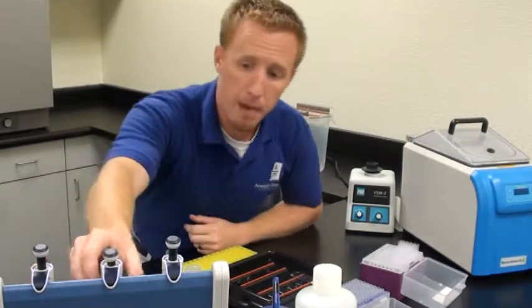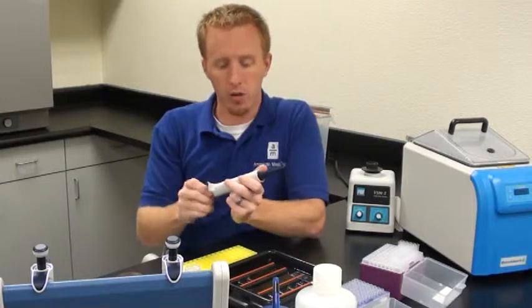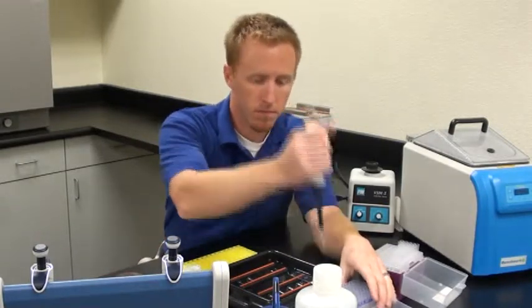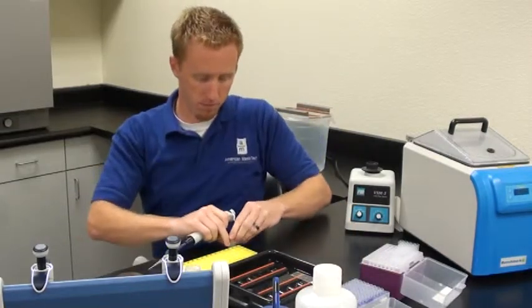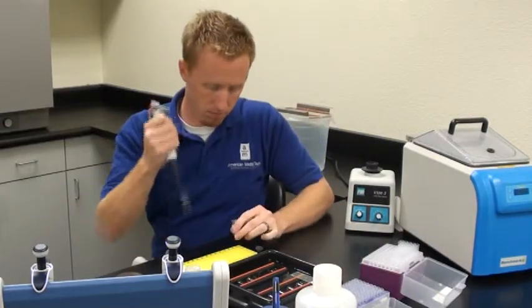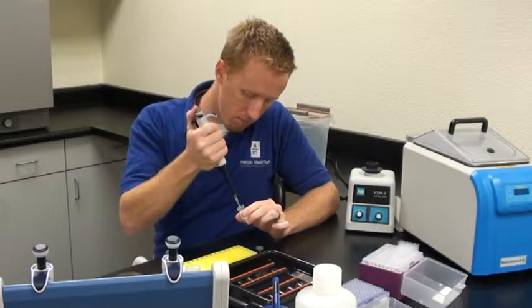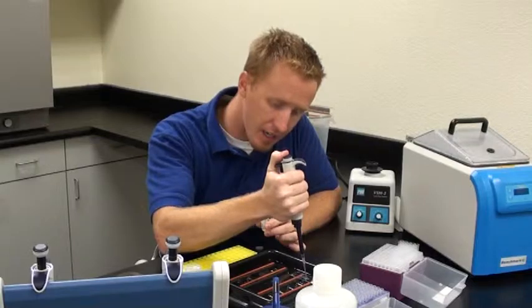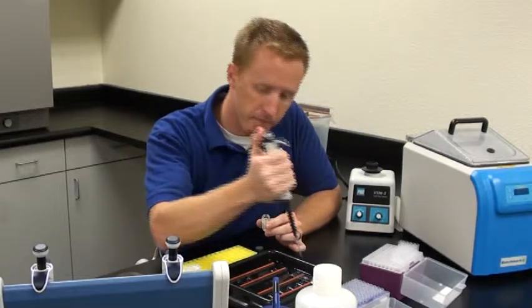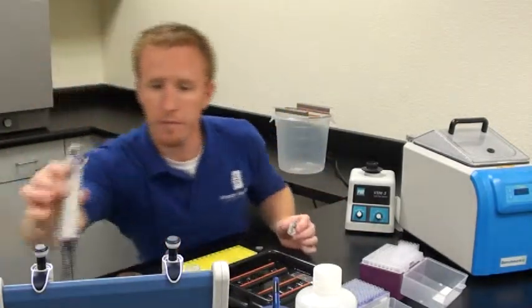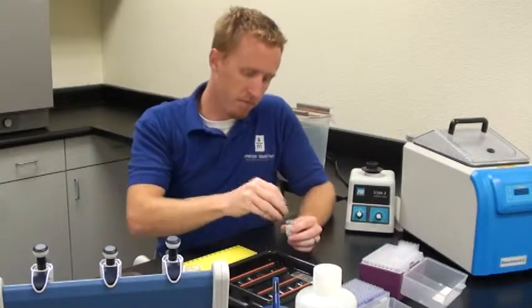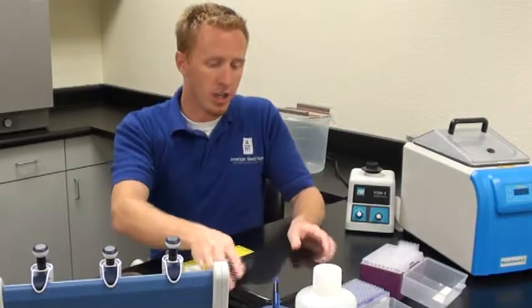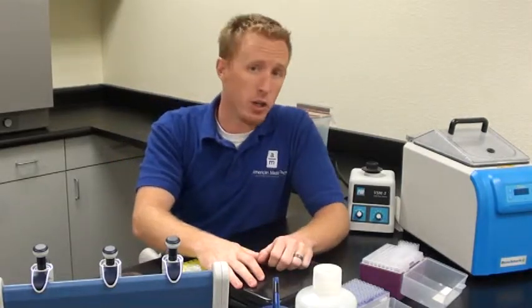Remember, 100 microliters. Double check your pipetter. Be sure to cover that entire tissue section. We'll cover the humidity chamber with its lid and let this sit for 30 minutes.